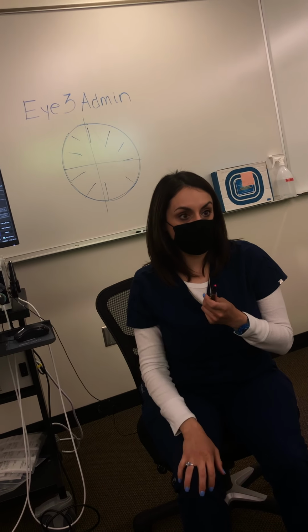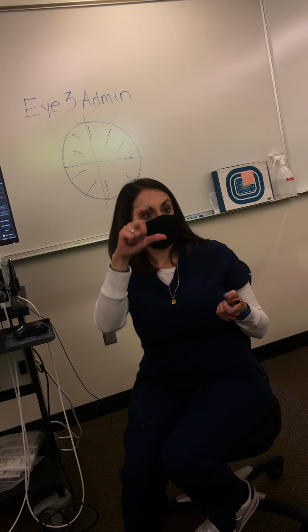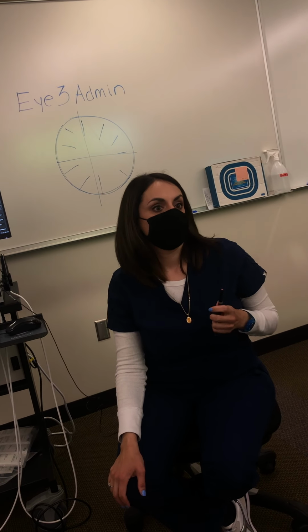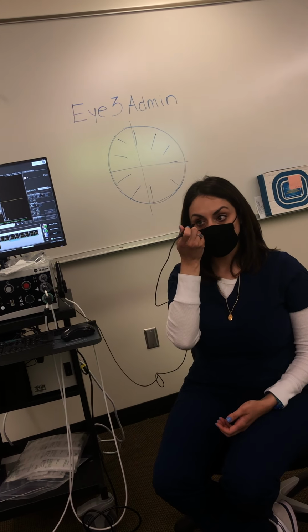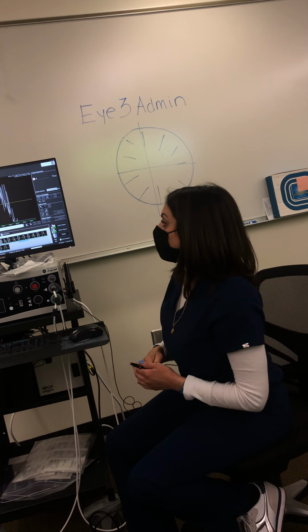Fill up the cup with Goniosol, which is really gross. Okay, so first the Proparacaine, then the saline, and then the cup on top of the Proparacaine, and then the saline in the cup. Exactly. And if it's just contact, say if the patient can't lay supine or can't tolerate immersion, then you're just going to do your Proparacaine and go straight on. Which is what we did in the lab.